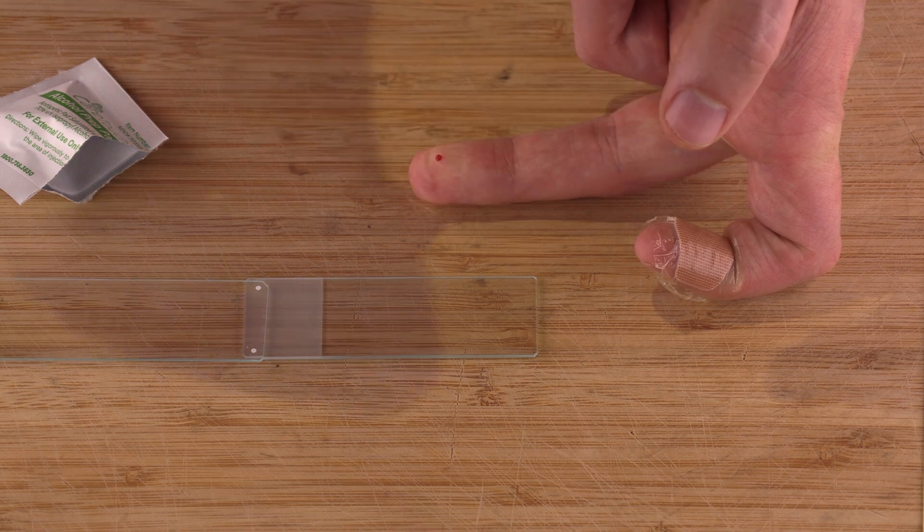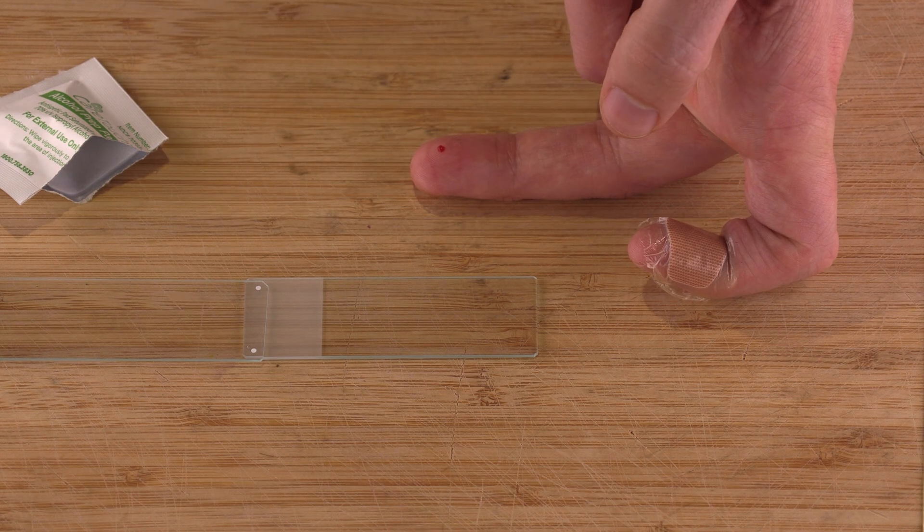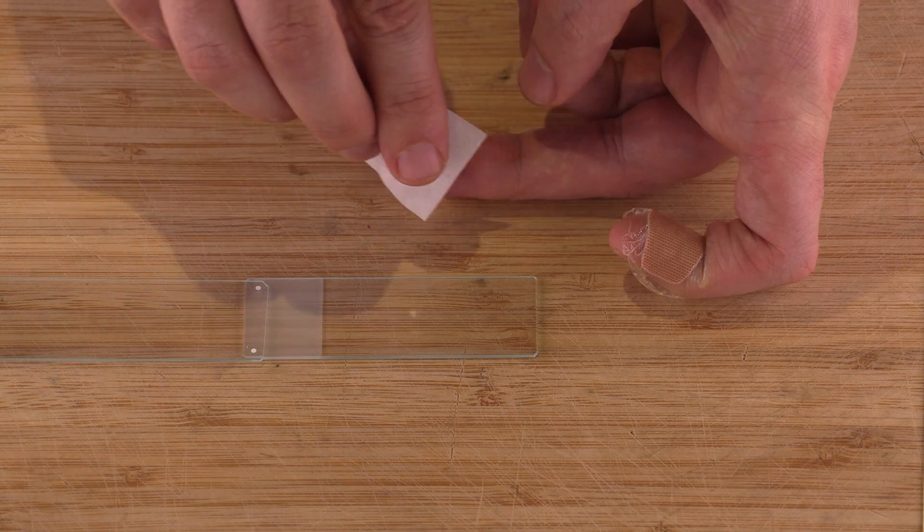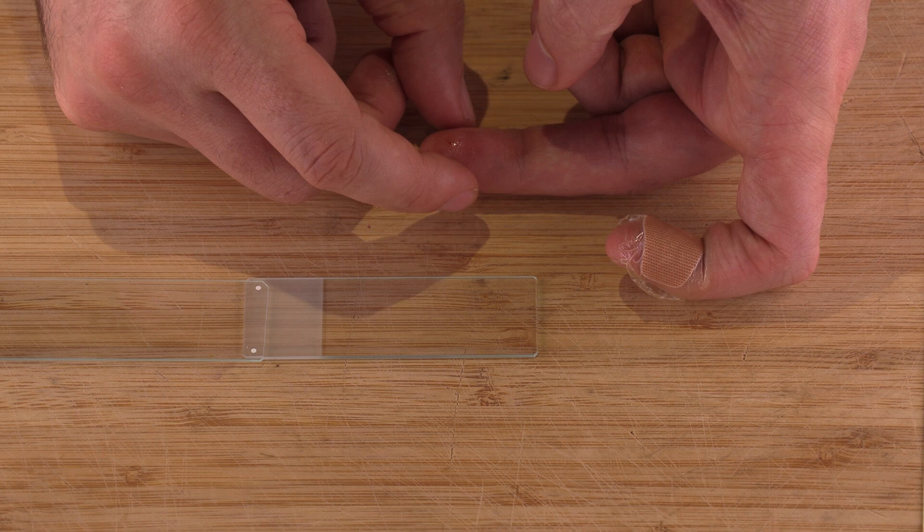Then I push down. This is a one-time prick and that thing won't be usable again so no chance of infection. The first little bit of blood that comes out it's not useful so I just wipe that right off.